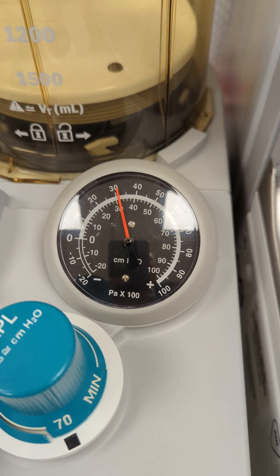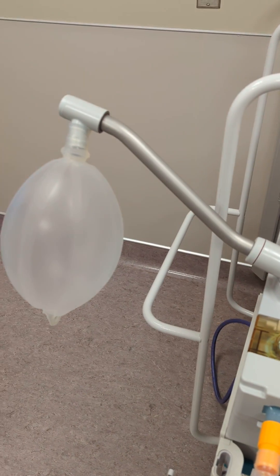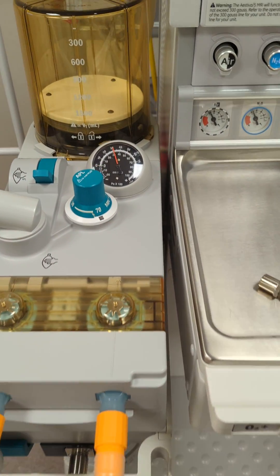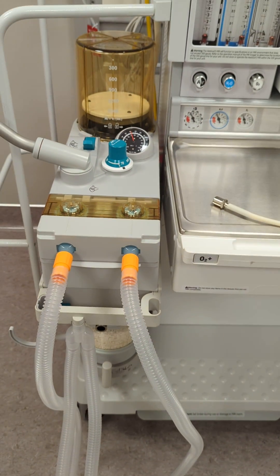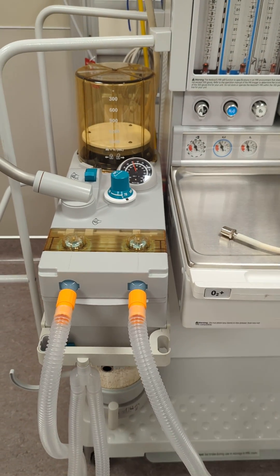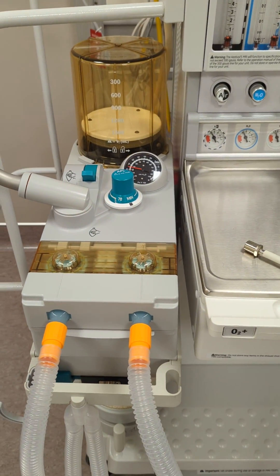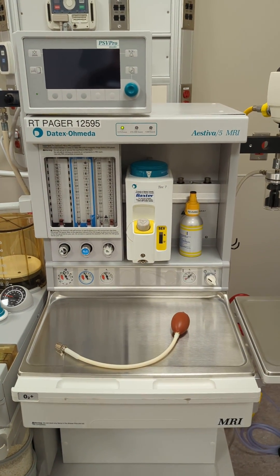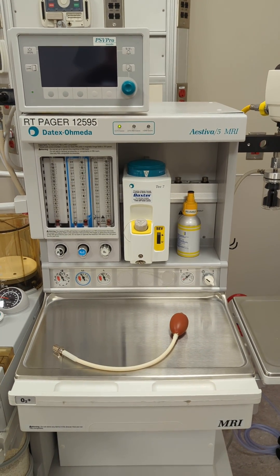You will notice it will drop down slightly to allow for the compliance within the system itself. Watch for 15 seconds. If the pressure remains the same, your leak test for the circuit has passed. You can then return your APL valve to minimum and you are done with your test. That concludes our pre-use leak tests for our Aestiva 5 MRI anesthetic gas machine.